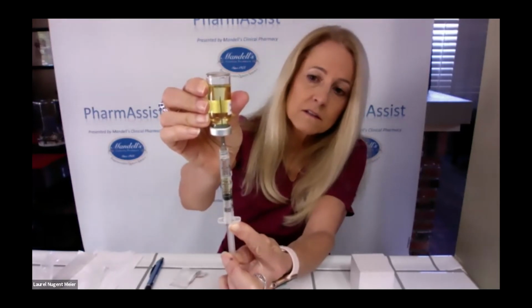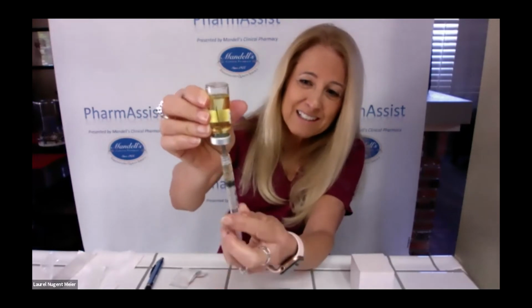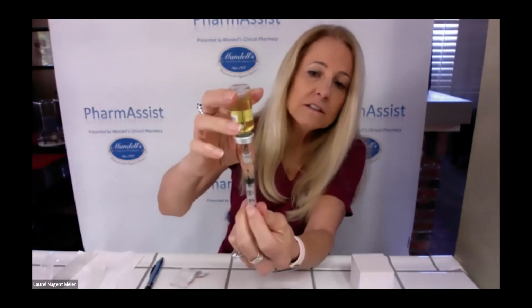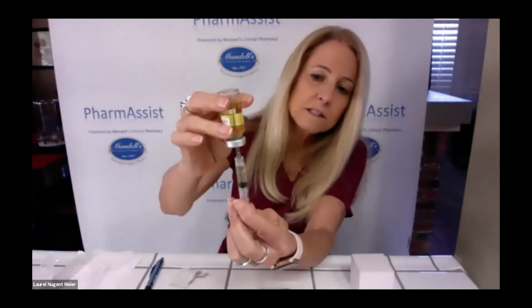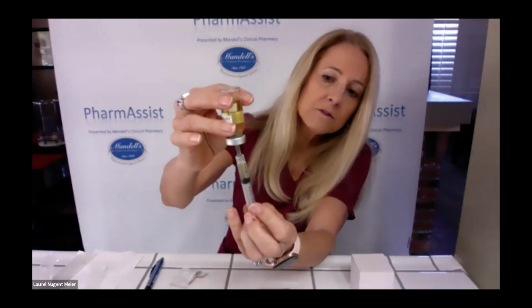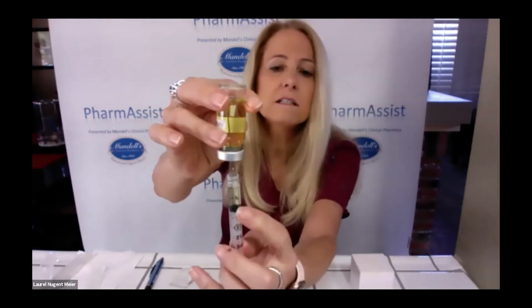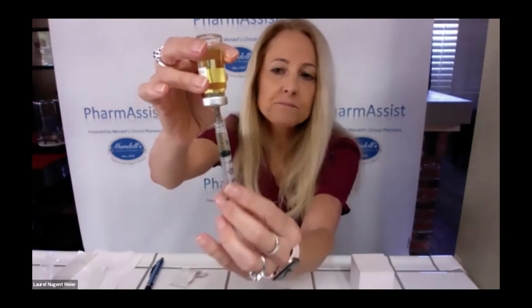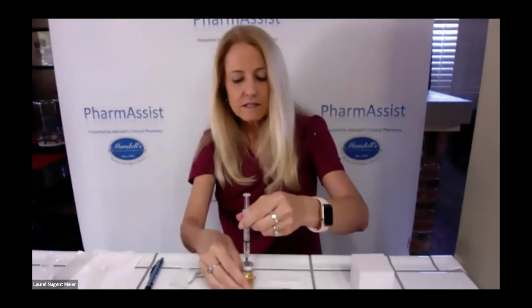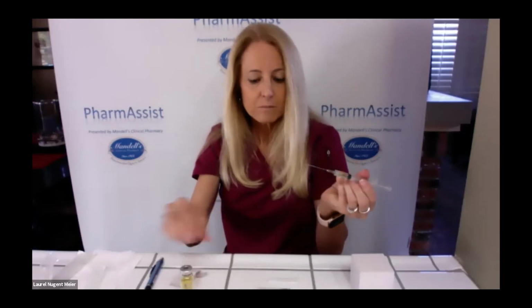And you do have to be patient with this one. And then push out. If you see little teeny bubbles, you can ignore them, but any large bubbles you're going to want to get rid of. And you push right to the 1 line so that the black line is on the 1 line. Turn it back up, right side up, take the needle out, and you want to recap with a one-handed technique.